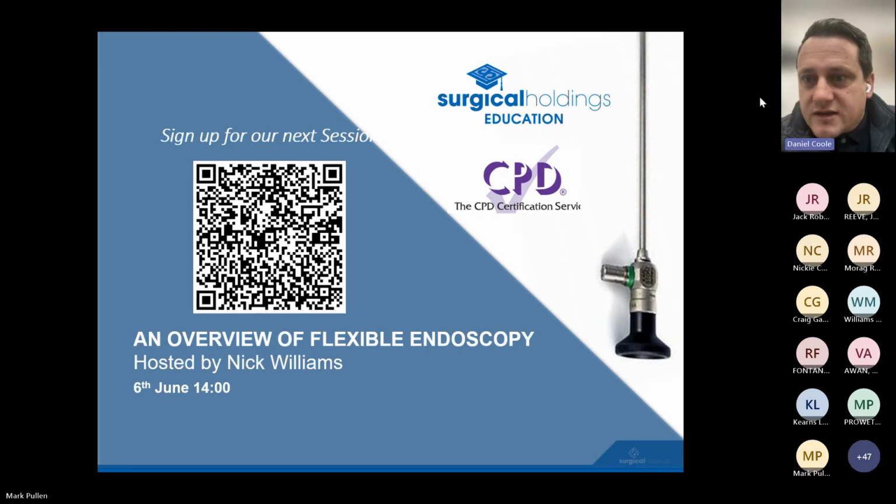So Jack kindly added a comment about preventing water ingress. There are no active preventatives, but always pay attention to chemicals used during the cleaning process, as they can potentially affect the solder joint. So that is something to bear in mind. Of course, there are different cleaning chemicals, some of them more aggressive than others. There's also water to bear in mind, water quality and different minerals you get in the water. So these are some natural and some artificial ways that can potentially break down the scope during reprocessing.